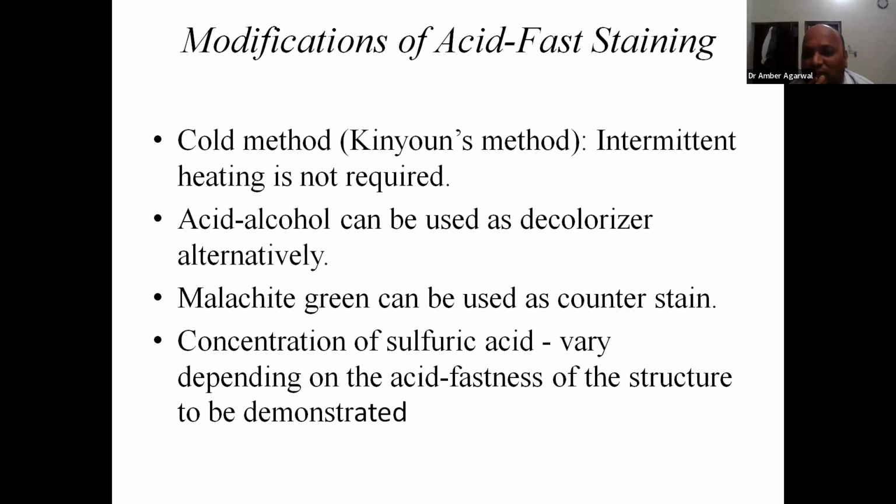So that is missed. That is why it is useful, but it all depends, because we cannot send for the cold method in every patient. It won't happen, so only in specific cases does it need to be sent.